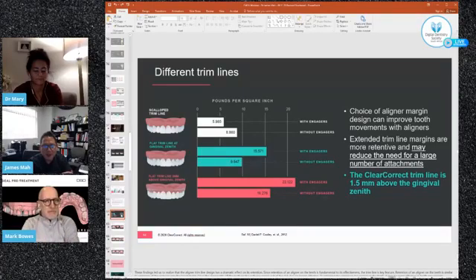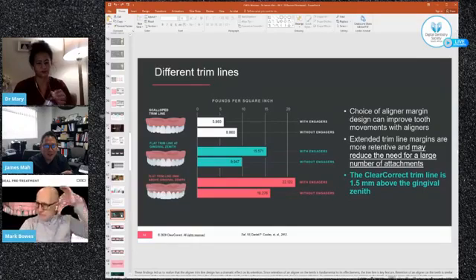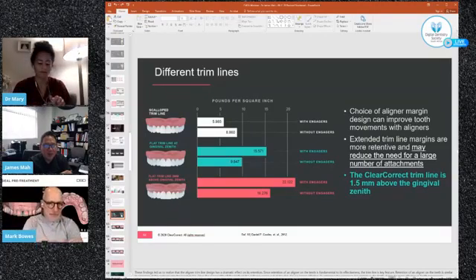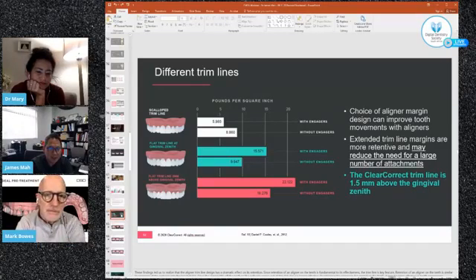And without getting too deep into it, I'm also an adjunct professor at the University of Alberta, where we have an orthodontic simulator, and we're conducting these tests. It's basically a full dentition with mechanical force transducers on each and every single tooth. And so when we apply an intended movement, such as torque, which is one of the controversial ones, with and without attachment, is there going to be a difference? So we have a PhD student working on that, and hopefully we'll have some answers as far as what advantage or not that attachments confer to the system.